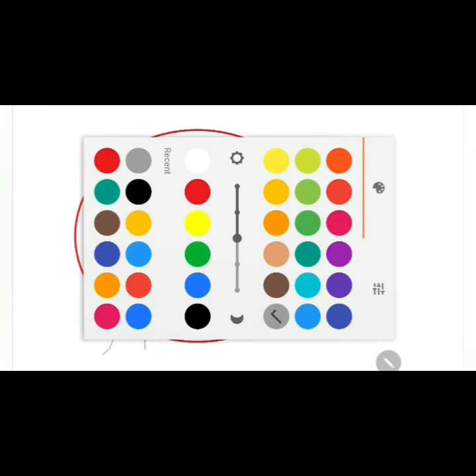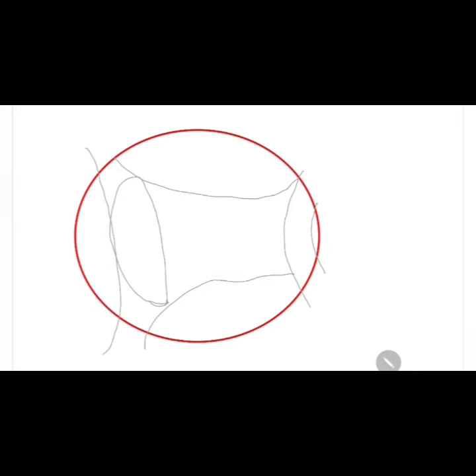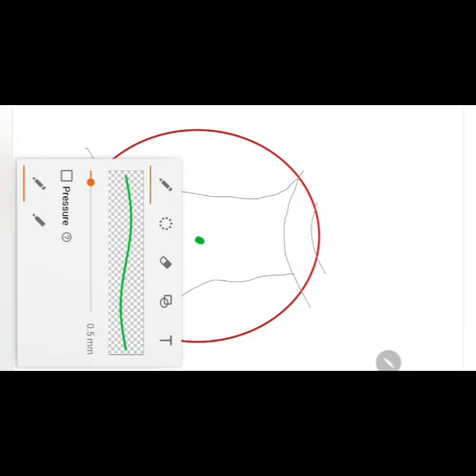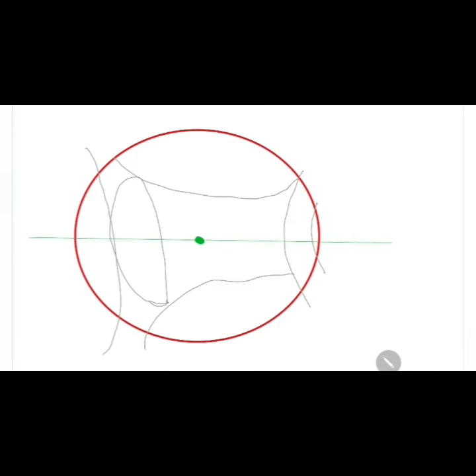Right. Okay, so we'll start placing the electrode. First we'll start from the center, right? So now this is a center. To help us know that it is a center, let's draw a line. Okay, this side is the left side, this is the right side, this is the central line.